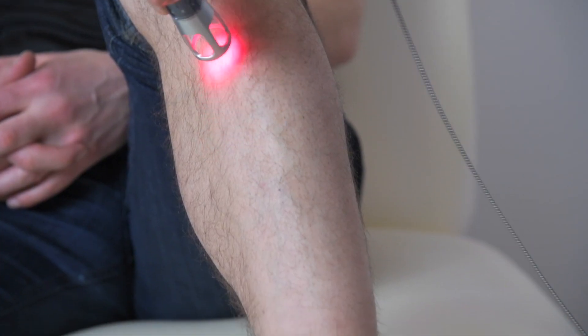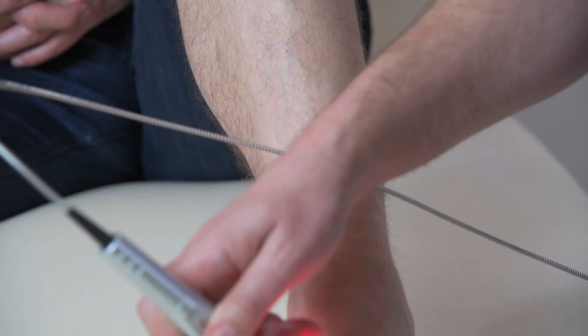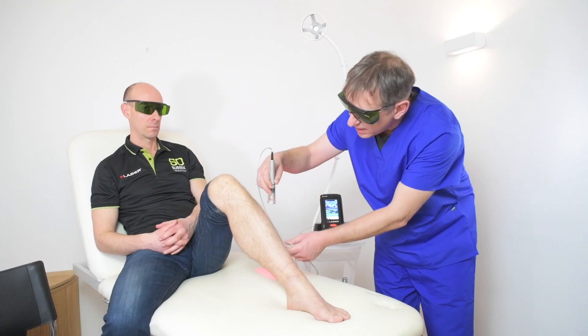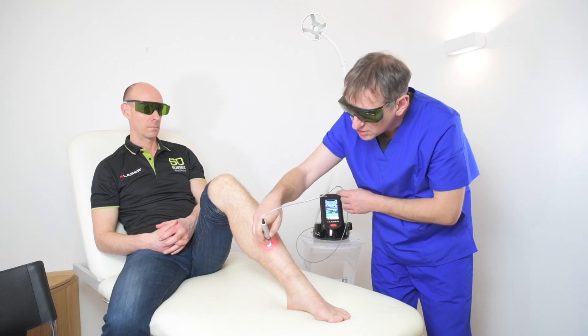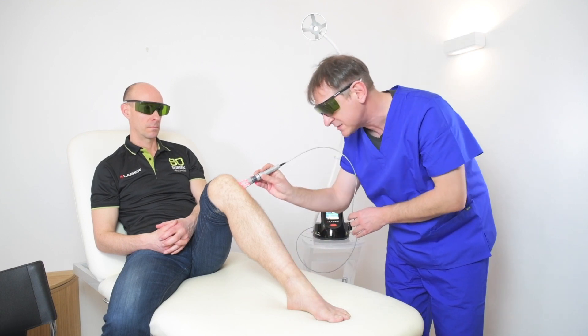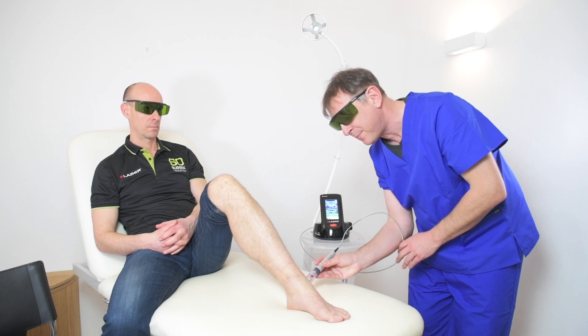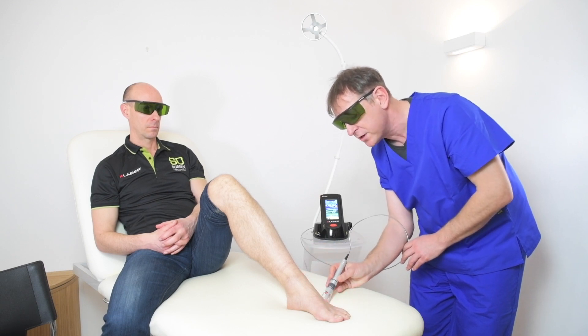We are working constantly at areas to enhance perfusion and to enhance blood flow to the lower leg, and in doing this we're able to increase the oxygenation, increase the ability of the electrolytes and metabolites, and improve the overall environment.